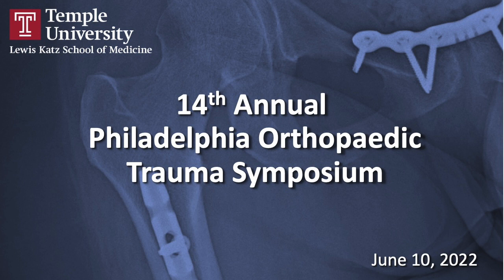The other comment I'd like to make is, actually everybody mentioned it, this thermal necrosis issue. Once you create a thermal injury to the bone from the insertion of a pin, there's no recovery. The bone's dead. It's going to be loose, potentially get infected. So thermal necrosis when you're putting in pins and pre-drilling, and Susan mentioned water cooling, particularly for definitive frames, I think can't be overemphasized.